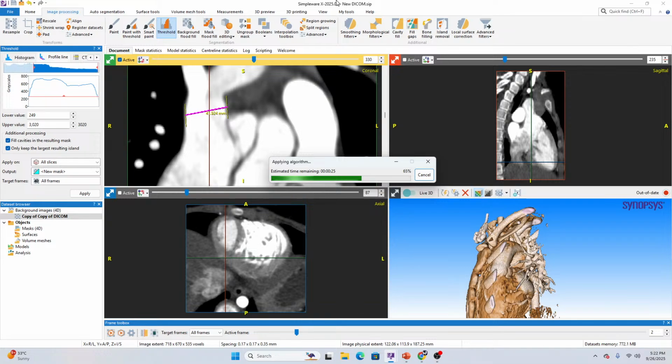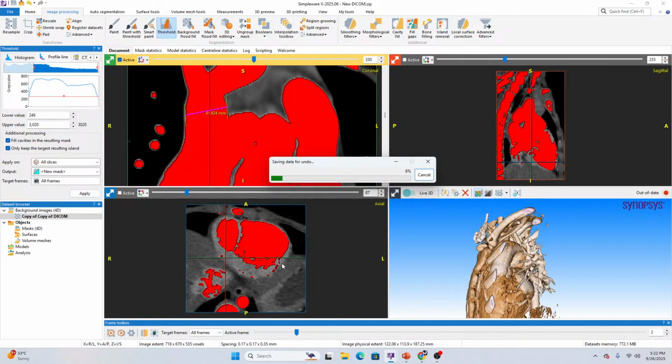Yes. So once it is done, since we have used it for all the particular target frames, whenever we work in this frame toolbox, we can check the segmented result corresponding to each and every time frame, whichever is required. And once the segmentation is completed, we first need to click on generate a fast preview to observe the results more clearly.